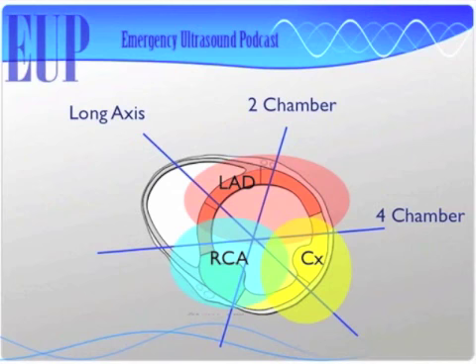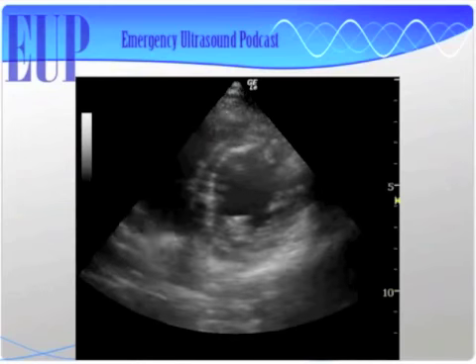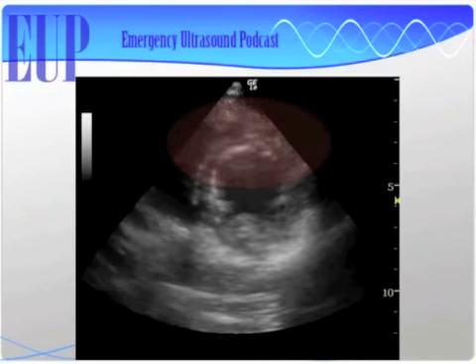I had 4 yesterday. Okay, great. Thanks. So clearly, not everybody is... not many. They usually have a strong history. Not everybody is your young, healthy person who's having their primary lesion. So it's nice to be able to look at this and know what's what. So you're telling me I might actually have to think about some of this. I might. All right, so here we go.